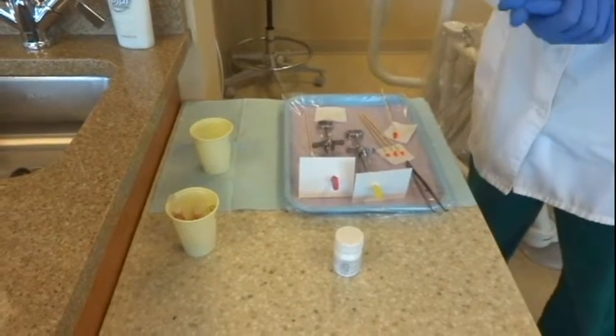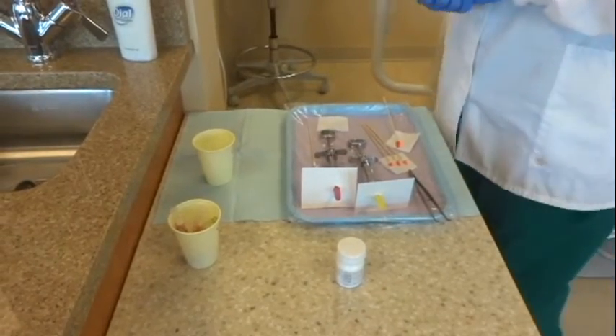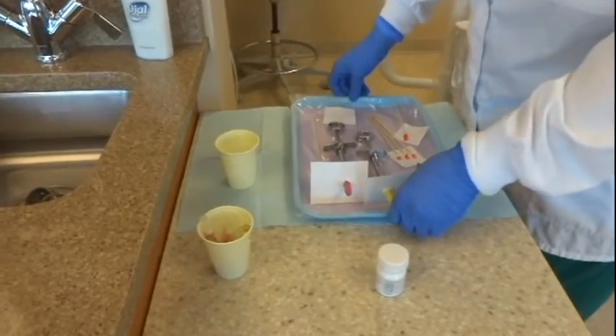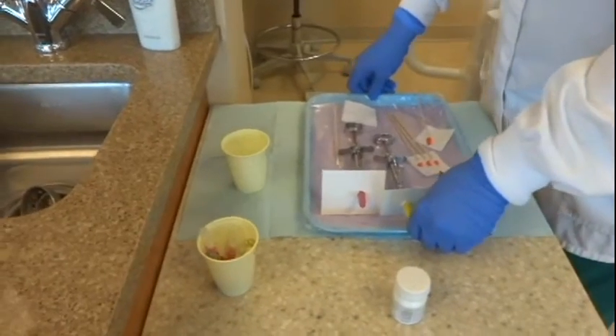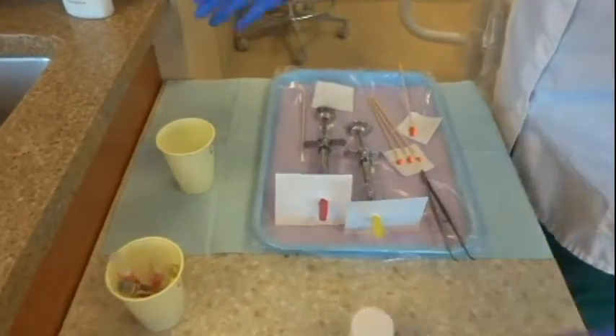I'm going to teach you how to set up for local anesthetic lab — how to set up your tray for giving local anesthetic in lab or with a patient. First of all, let's start with the cart.